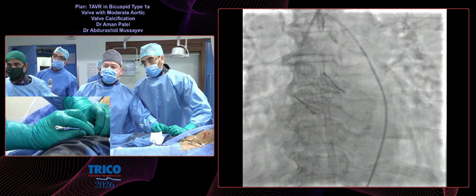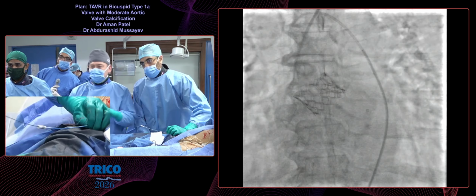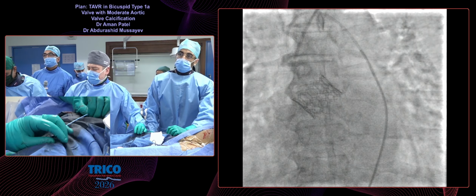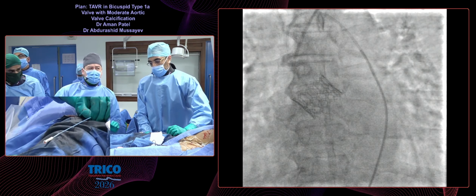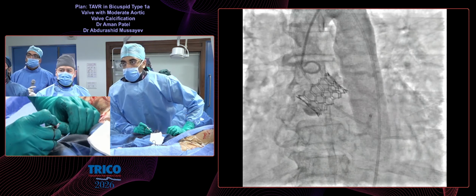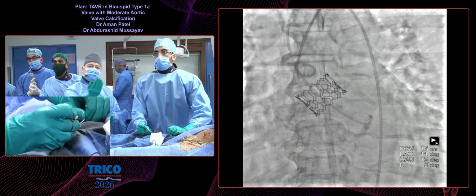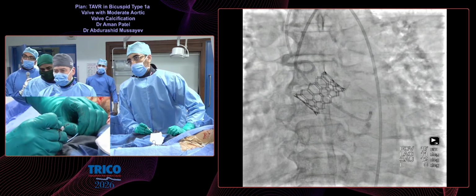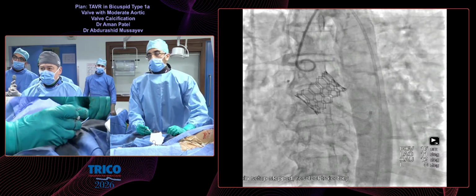Okay, we could fix it in the LVOT. Yes. Okay, remove. Remove. Fluoro. Okay, ready? Let me go down a bit. Okay, good. Ready for angio? Please inject. So we don't see any leak. It looks quite good. There is no paravalvular leak. And in the coplanar view? Zero paravalvular leak. One coplanar view, please. Yeah, cusp overlap view.